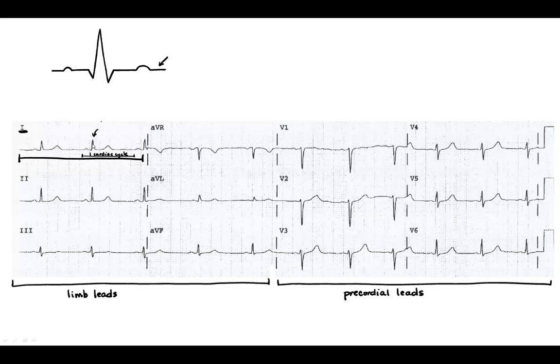here is a small hump that starts off the cardiac cycle, and that small hump can be found here in our textbook diagram, and this is actually the P wave. And then we have a tiny dip. It's almost invisible, but you can still kind of see it. And that dip matches up with this dip, which is the Q wave. And then we have a large spike, and that spike is the R wave, and it corresponds to this, which is also an R wave.